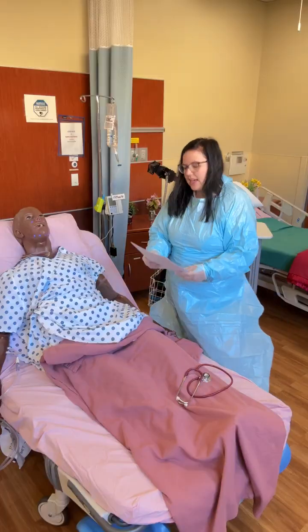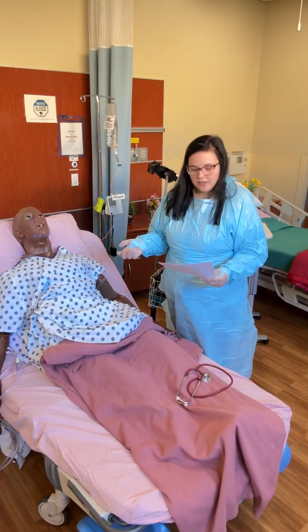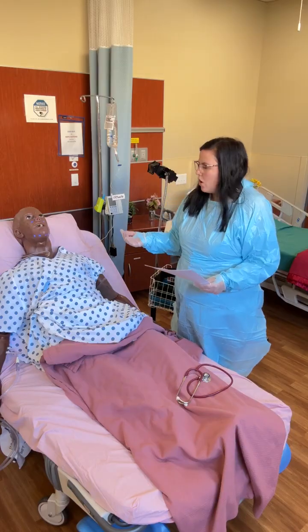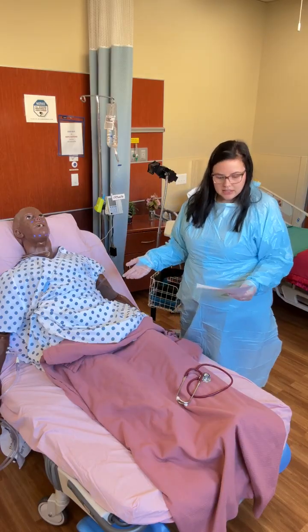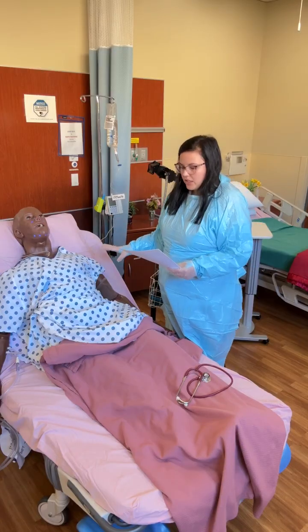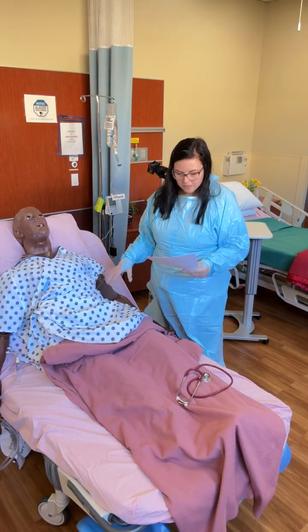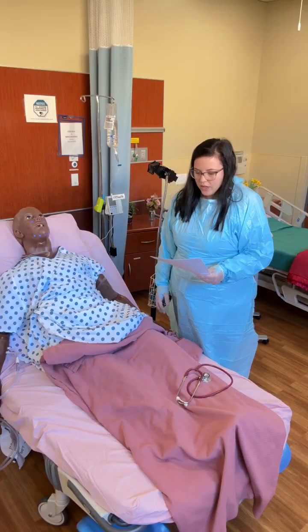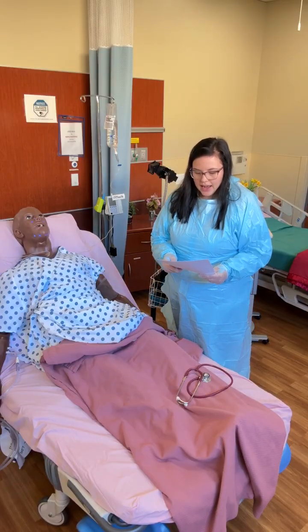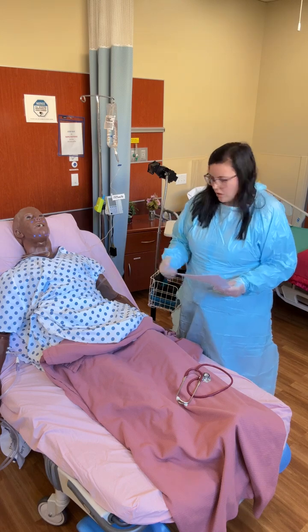When you're doing the head-to-toe assessment, it's important to ask the sim staff for the specifics. So if you want to know if the patient has palpable pulses, you can ask, but this simulator does have carotid, brachial, and radial pulses that you can palpate. When you're assessing the skin, you're going to want to ask appropriate assessment questions, and we will answer you accordingly.